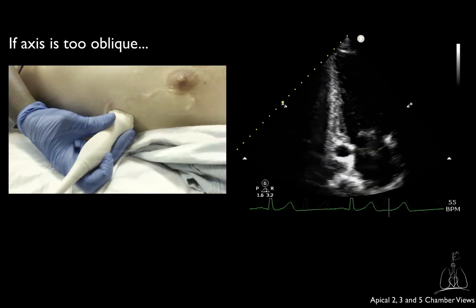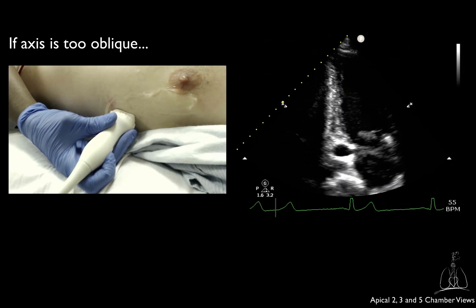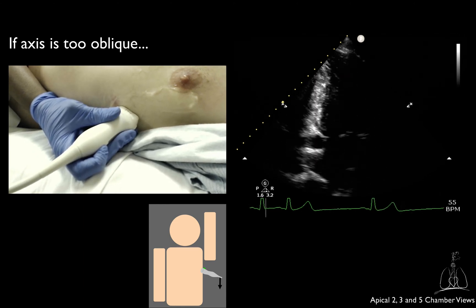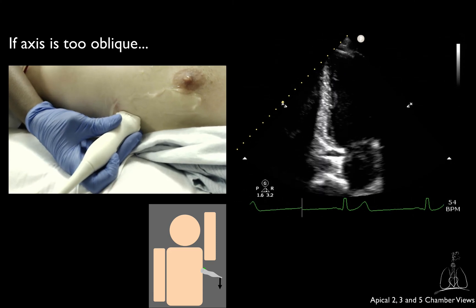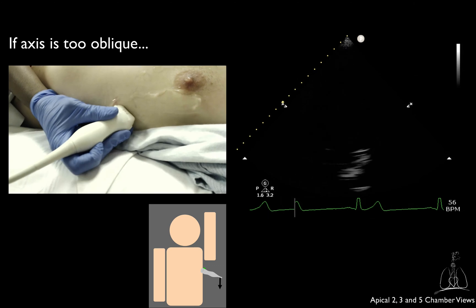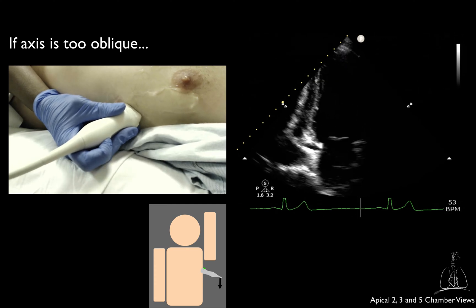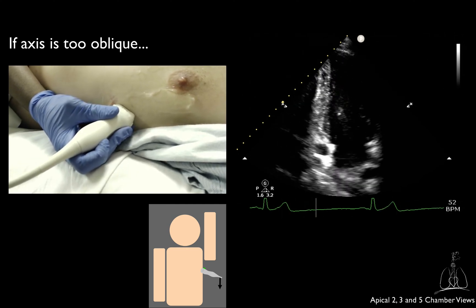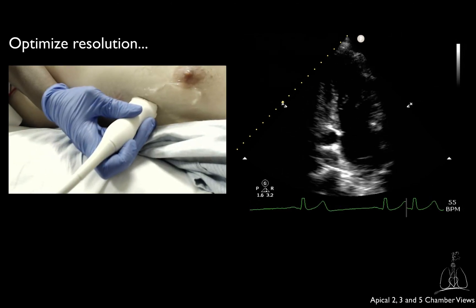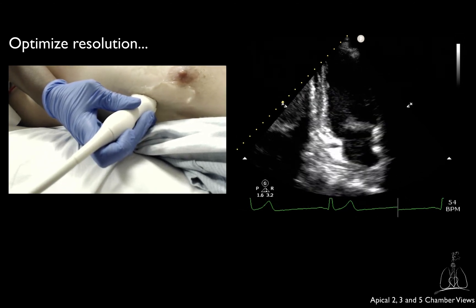If the axis of your 2 chamber is too oblique from one side, usually with the left atrium towards the right lower corner of the screen, try to rock the probe with the marker looking upwards. If the resolution is not optimal, remember to slide millimeter by millimeter on the skin until you obtain a good definition. Sliding within the same intercostal space may also help.